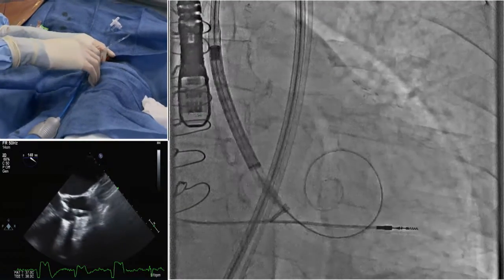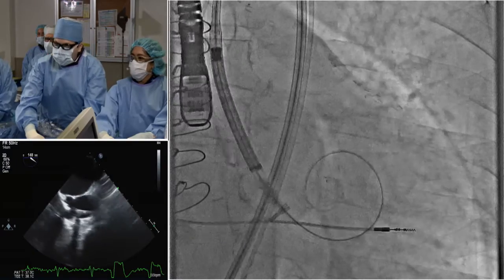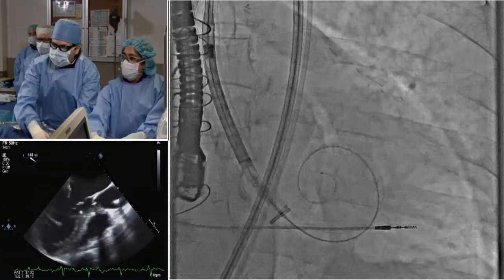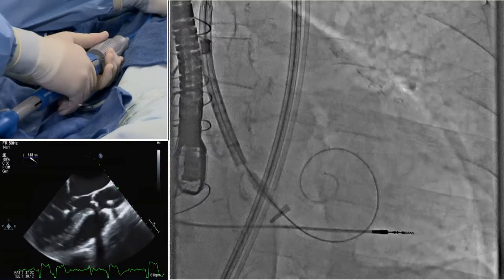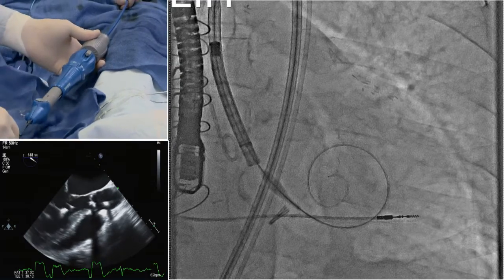Okay. So we're going to just start our deployment. One second, we'll let you guys discuss while we just continue working, okay? I guess they chose to put a sheath in place because of the aneurysm. I guess the aorta was really our issue. We wanted to protect the aorta. Stop there. Okay, we're going to do an angio. Just turn back. Nico, do you want to intervene?